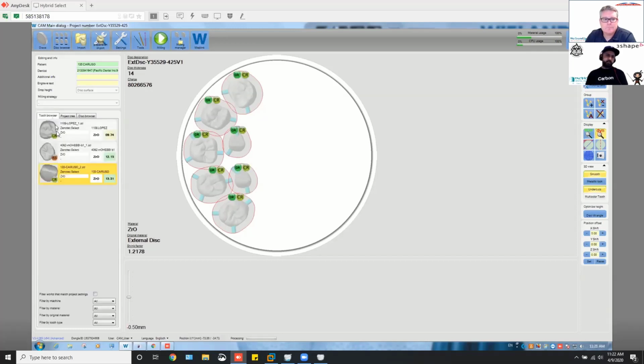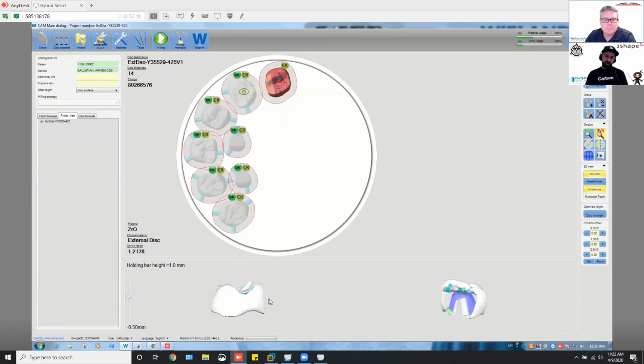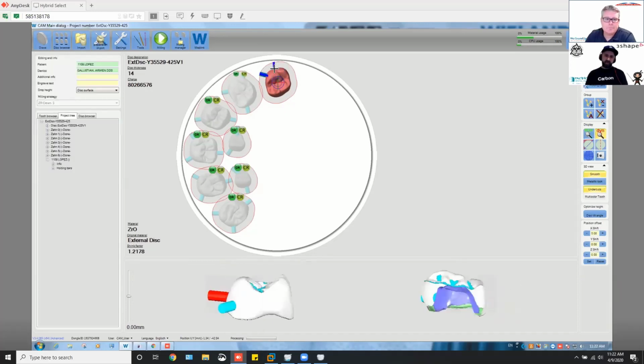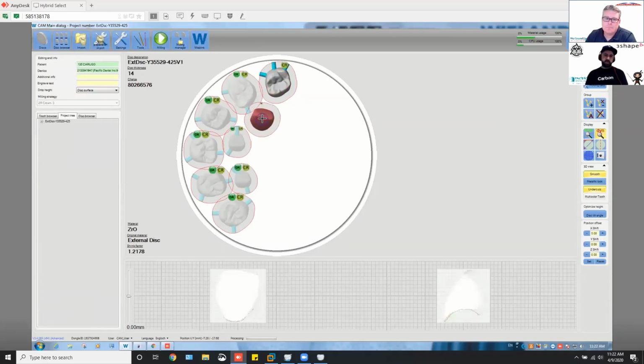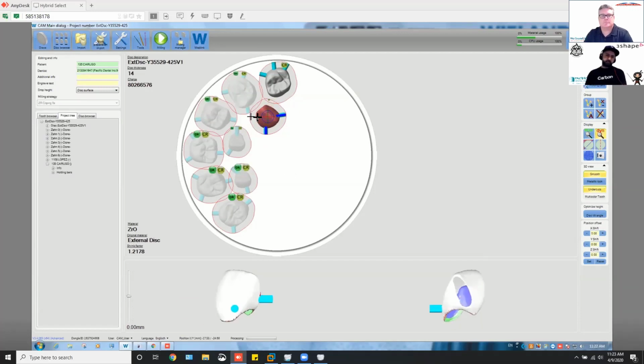But for instance, if I bring in a screw retained crown right here, you can see this case is pretty much even all the way around. It's got a nice even wall from top to bottom. We practiced this when you were with me. We do a setup like this, do 3 crowns, and we do all of these this way. That way, when this whole row is all done, we can come in here and start nesting the second row right on top, and that brings me to this guy right here. And I don't have to worry about that pin. Let's say this pin was gone, I don't have to worry about that pin not being there. So that's a couple tips.